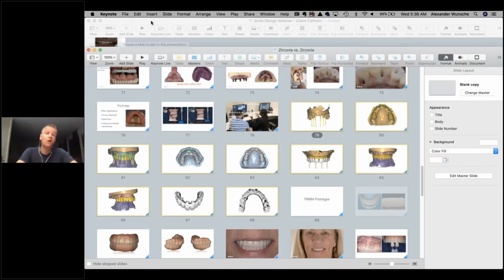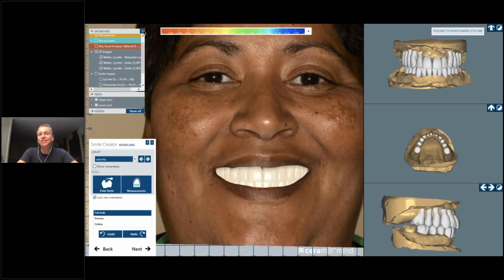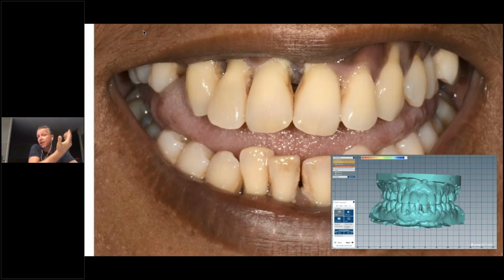She liked that. She said, oh yeah, that's so cool. I want to have a broad smile. And we'll see later she will change her mind. Yeah, it can sometimes be tricky. You can show a smile on the face, and she says, yes, this is amazing, I love it. And then you have to go back a little bit to reality. So on her now, we are basically planning this from A to Z before planning the implants.